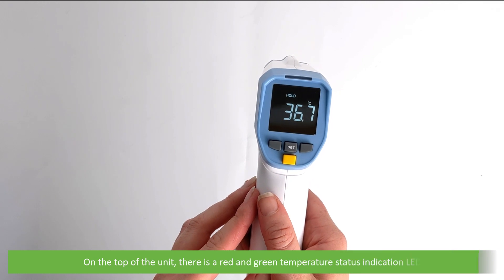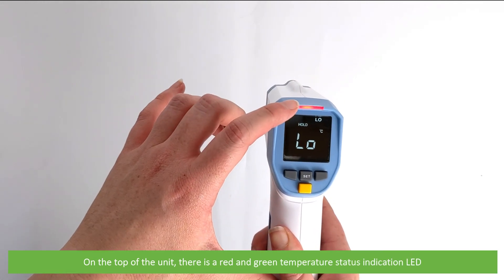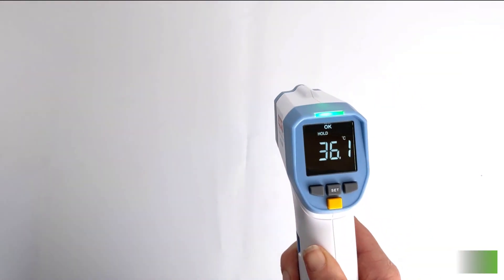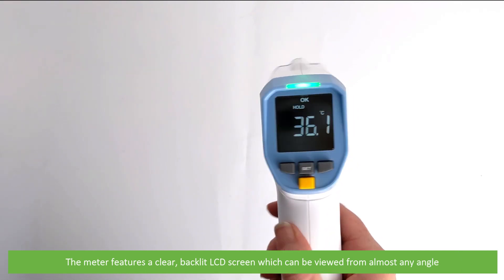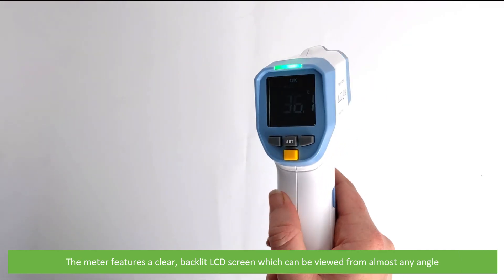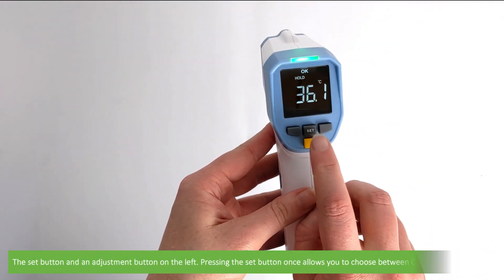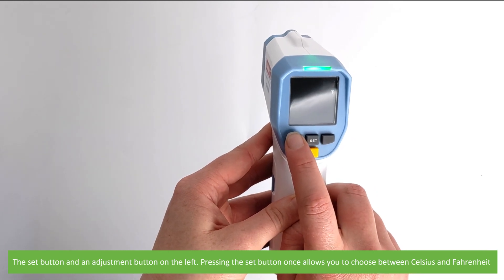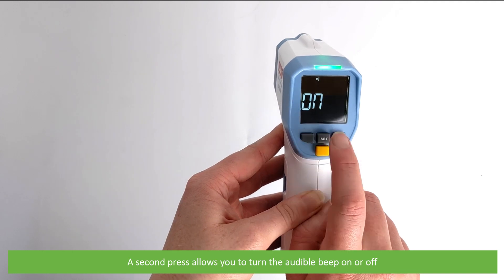On the top of the unit there is a red and green temperature status indication LED. The meter features a clear backlit LCD screen which can be viewed from almost any angle. There is a set button with an adjustment button on the left. Pressing the set button once allows you to choose between Celsius and Fahrenheit, and a second press allows you to turn the audible beep on or off.